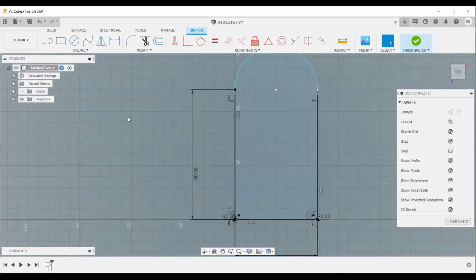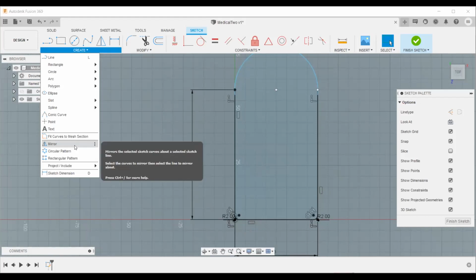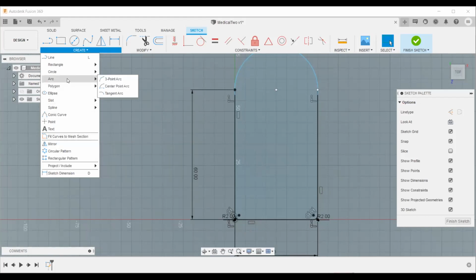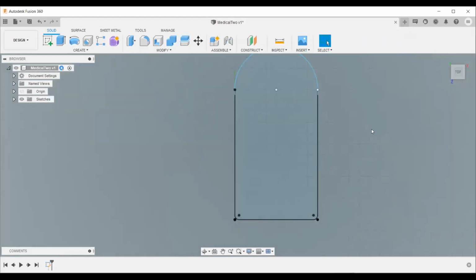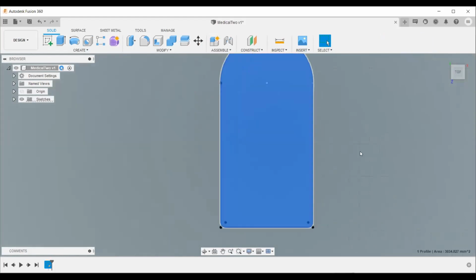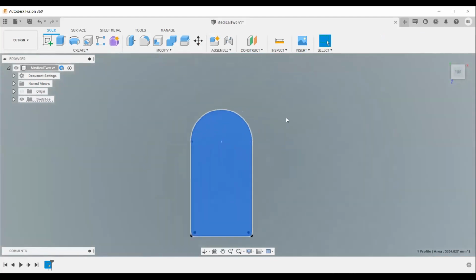Yes. Okay. So there are other things here which you are going to learn. You can create mirror, you can create arc. We are going to learn all this, but let's just start. So finish sketch. Finish sketch. So you are having something which looks like that. Everyone, are you there?